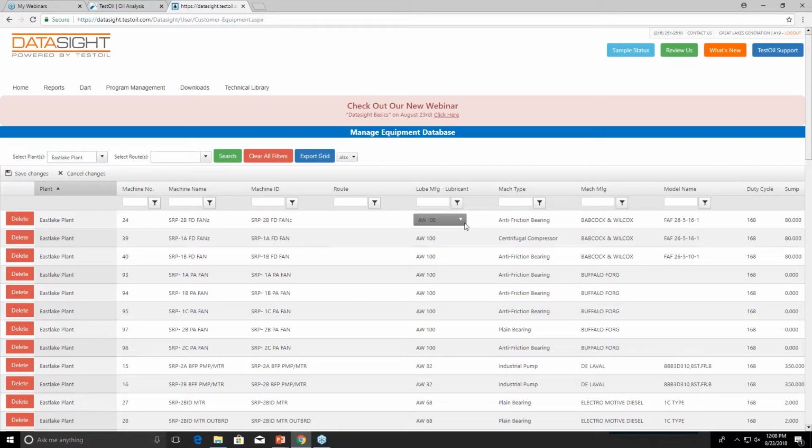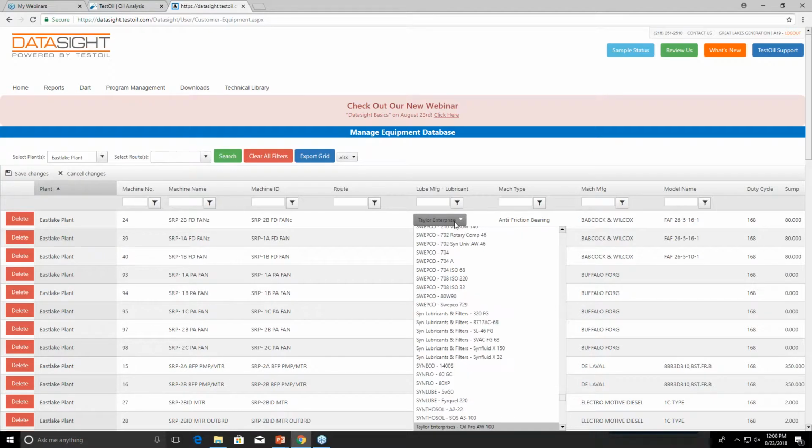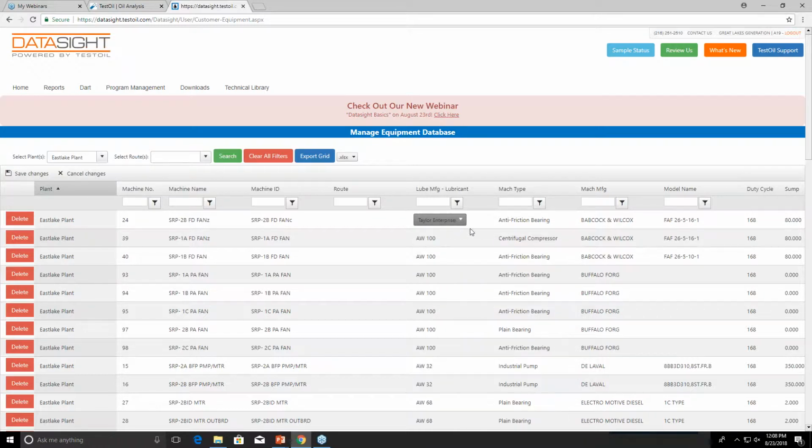And with the loop type, it's a drop down, which has a list of all of the manufacturers and loop types that we have in our system. You can go through the list, and it's also a smart filter. So if you start typing in here, it'll get you down to your manufacturer, make it easier for you to filter. And all of these areas can be modified.